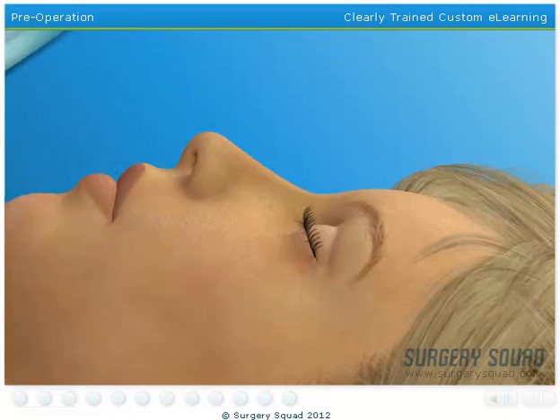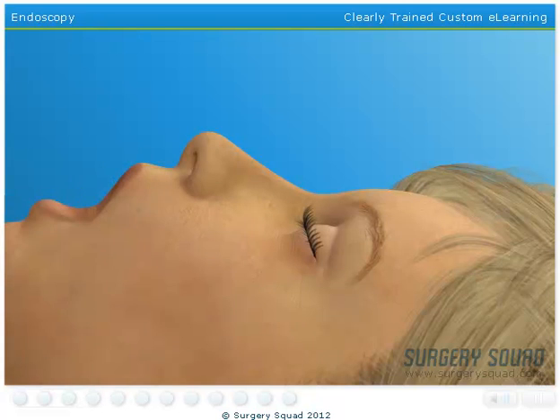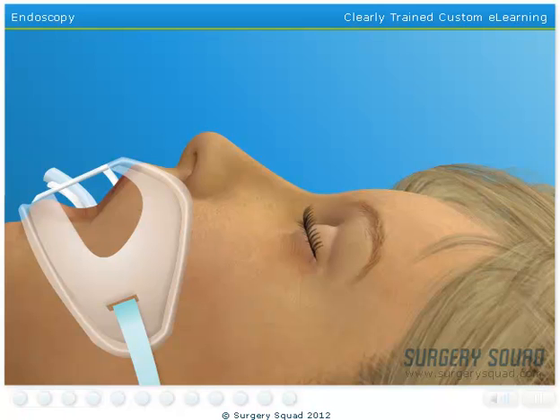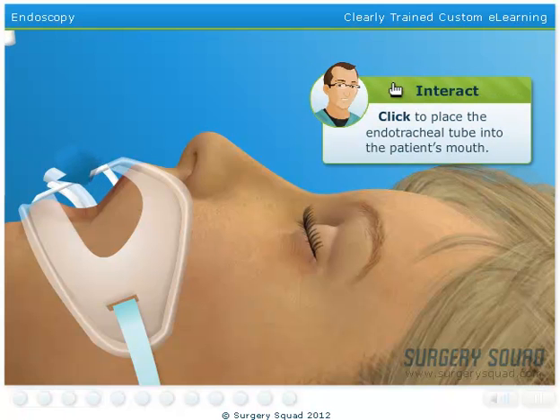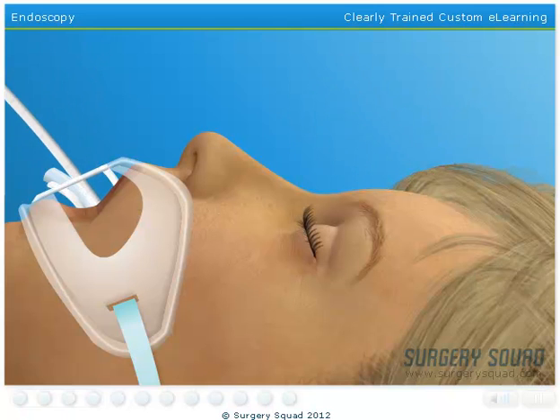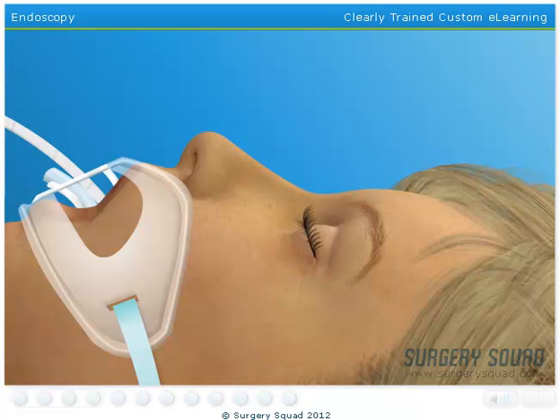Our patient has already been prepped and is sedated, thanks to our dedicated nursing staff and anesthesiologist. First, we'll insert an endotracheal, or breathing tube, in the patient's mouth and into her throat to help her breathe during the operation. Since I've already taken care of inserting a catheter into her bladder, we can move on to more important steps.